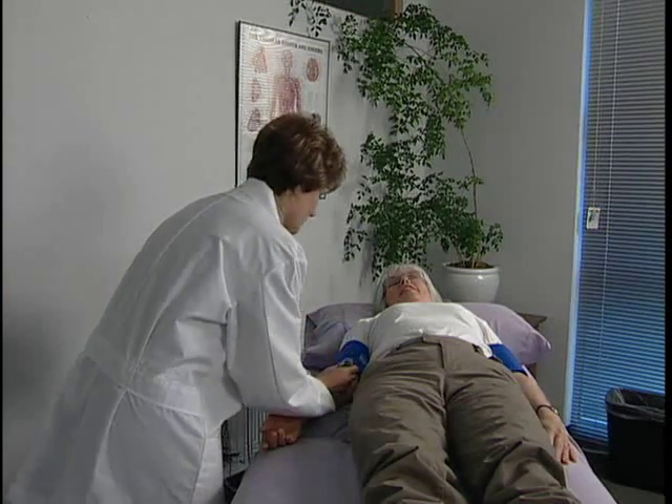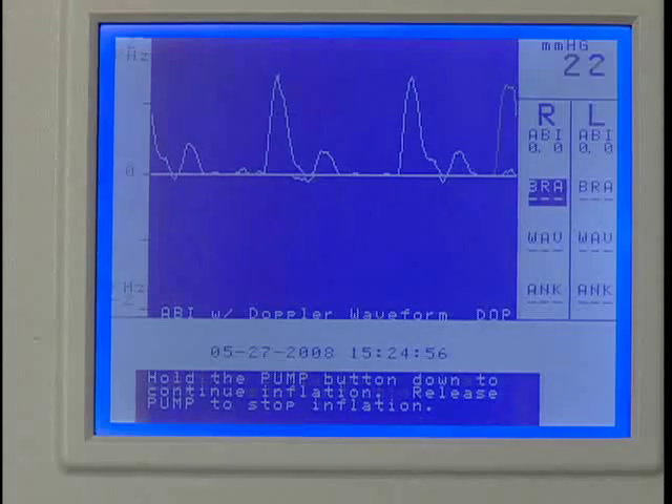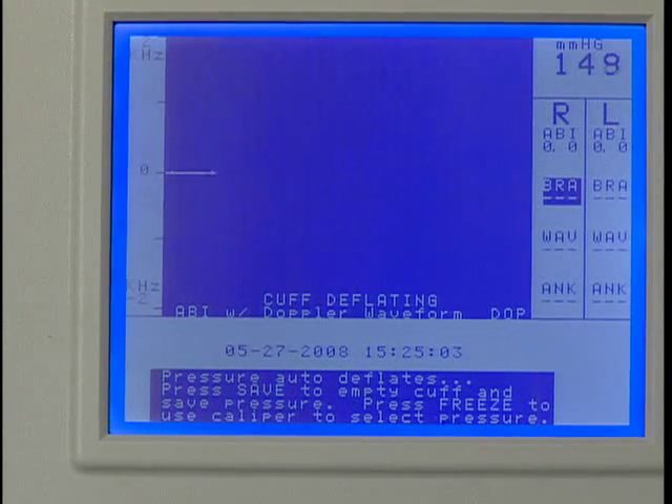Apply gel to the right brachial artery site and use the Doppler probe to listen to the blood flow. While holding the probe steady on the artery, press and hold pump to about 20 millimeters of mercury above the occlusion pressure. Release pump and the cuff will automatically start to deflate.